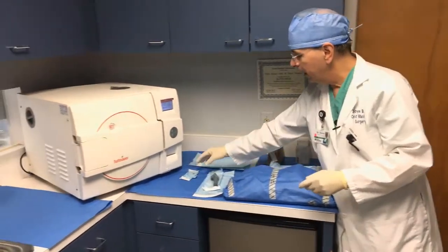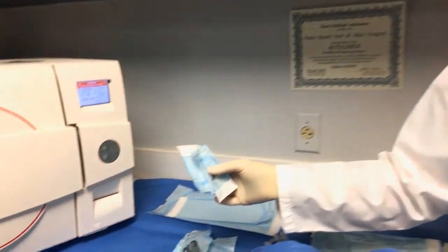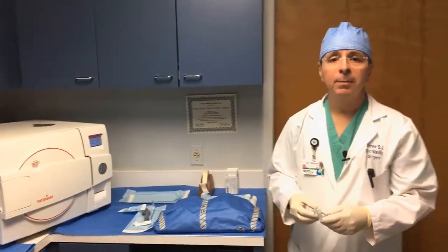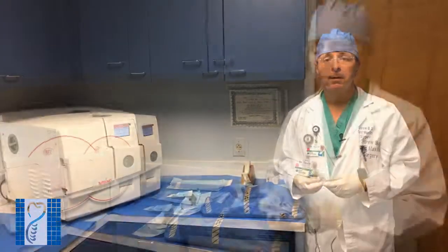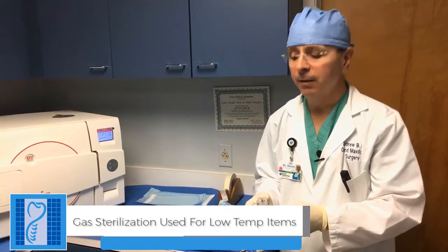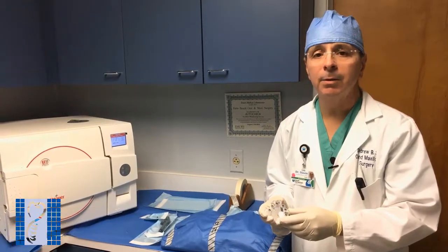Our smallest items are also sterilized. Everything that goes on the patient or in the patient achieves complete sterility. Certain items cannot be steam sterilized because they'll melt, so for those items we send them to the hospital and use their gas sterilizer, which achieves the same sterility as the steam autoclave but at a low temperature.